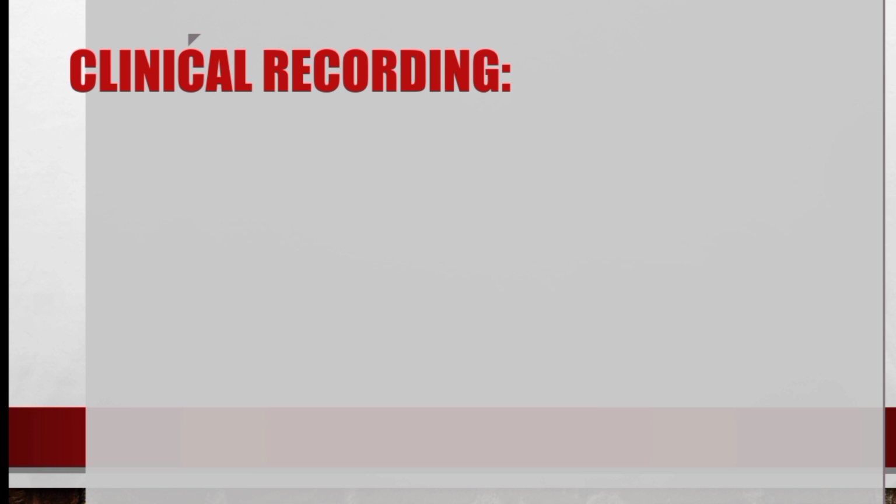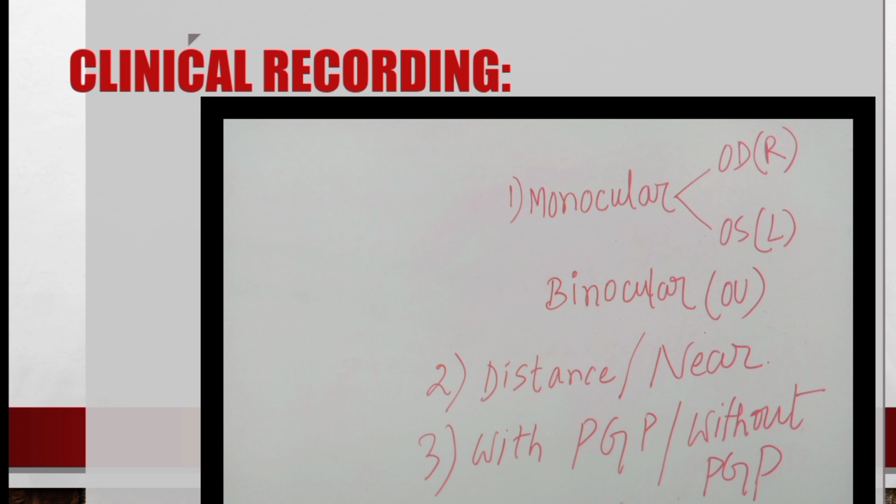To learn about the clinical recording, we need to understand three different things. As you all notice on the screen, the first one is monocular or binocular. So we need to measure the visual acuity monocularly, meaning one eye at a time, and then binocularly, meaning both eyes open. So in monocular visual acuity, when we measure visual acuity in the right eye, we will occlude the left eye with an occluder, and similarly when we measure visual acuity in the left eye, we will occlude the right eye with an occluder.